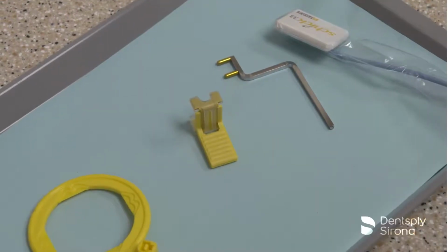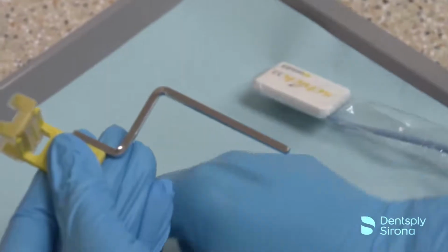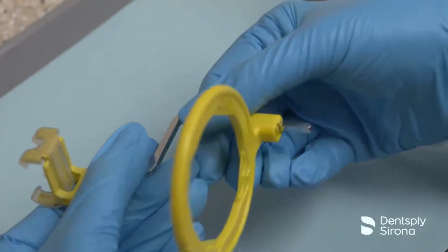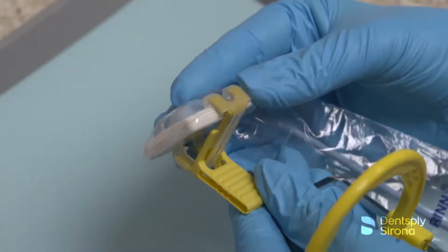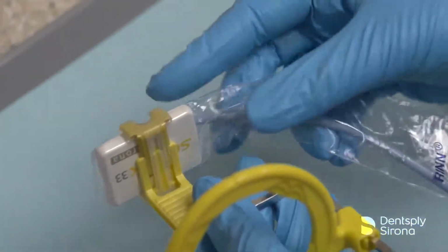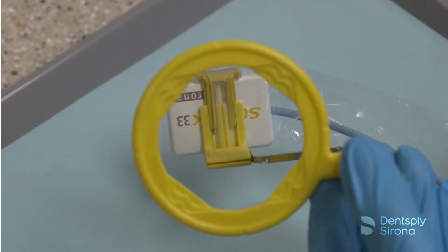To assemble the XCP Short Arm with XCP DS Fit posterior bite block, place the yellow pins on the arm into the side of the yellow bite block and slide the arm into the yellow end on the aiming ring. After placing the sensor into a RINN digital sensor cover, securely insert the sensor horizontally into the yellow bite block, making sure the active side of the sensor is against the flat surface of the bite block.